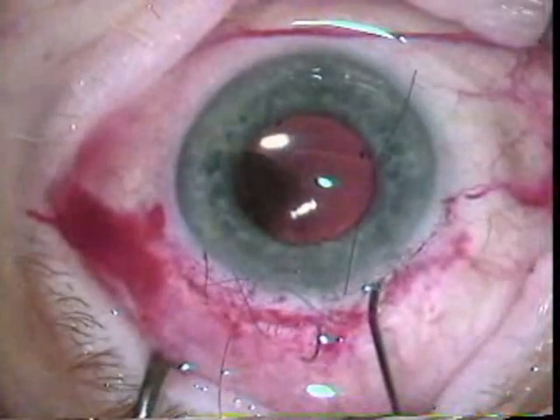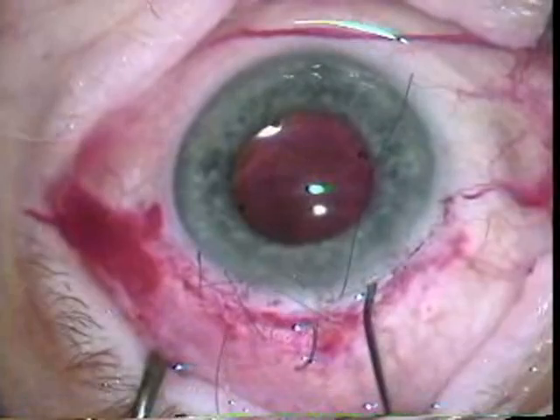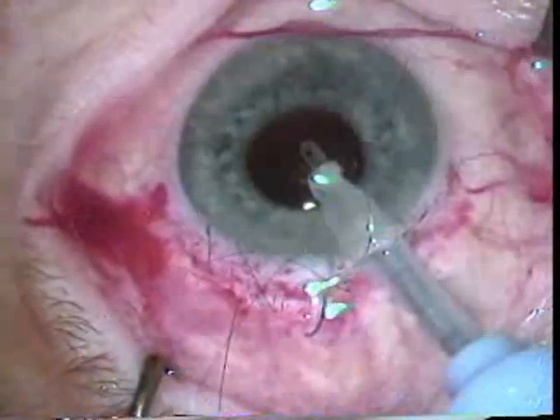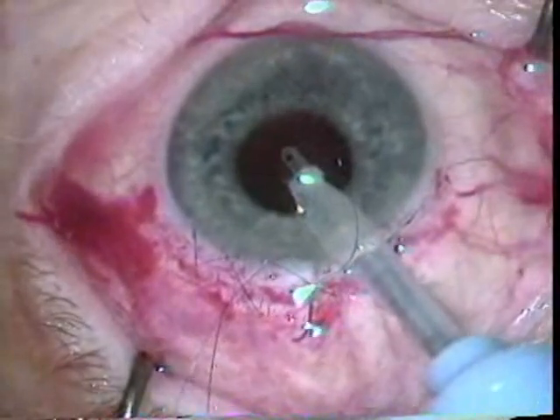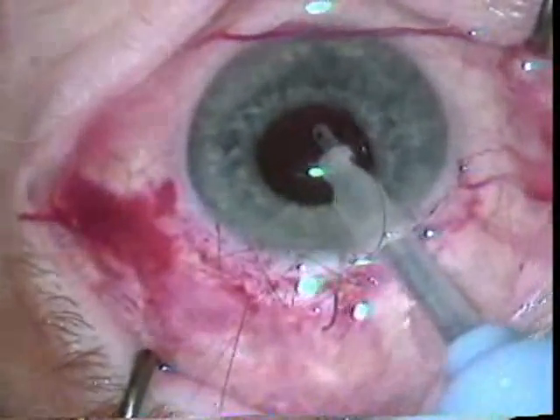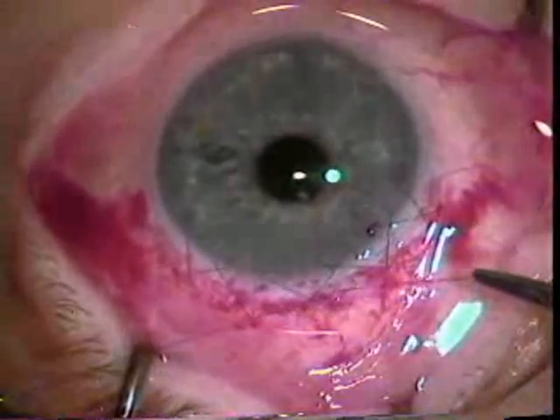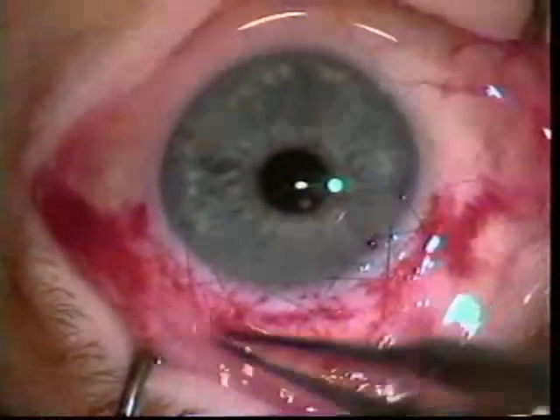Dr. Kolder does this nice closure with a running 10-0. Some residual viscoelastic material is removed, and then this 10-0 running nylon suture is closed. A beautiful example of a planned extracap.